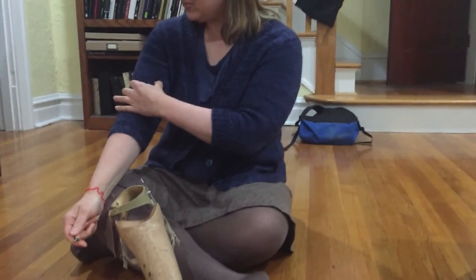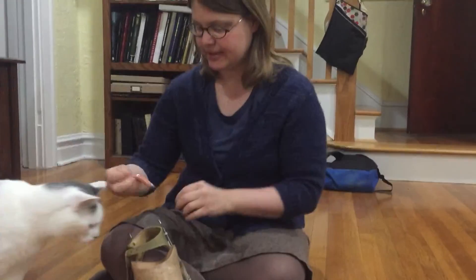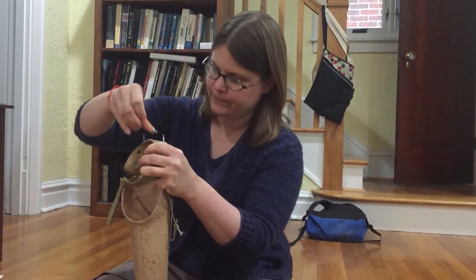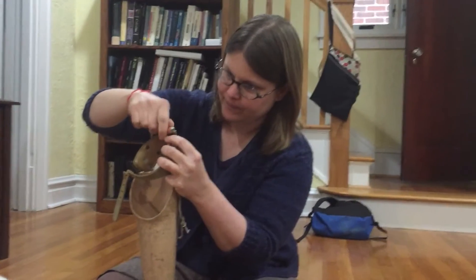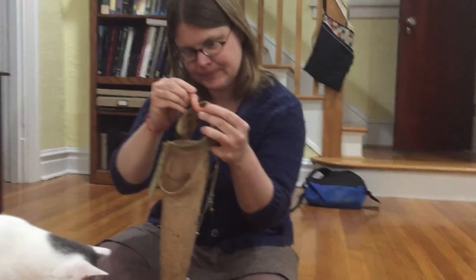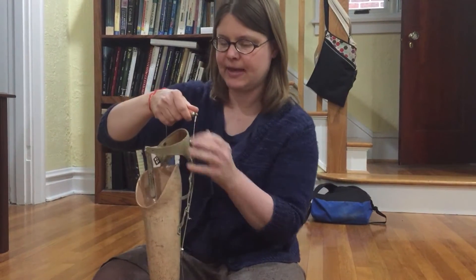Once the hole healed up, this rod fit through the tunnel in his bicep and then locked into his prosthesis like this. Just lock the box in there like that.